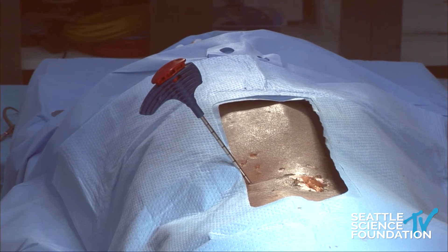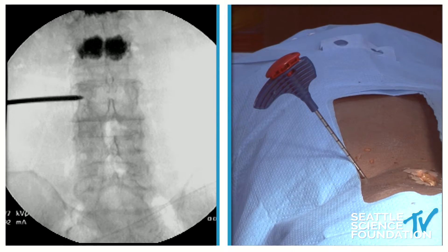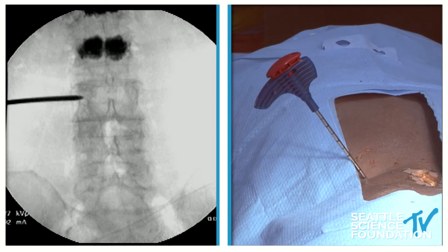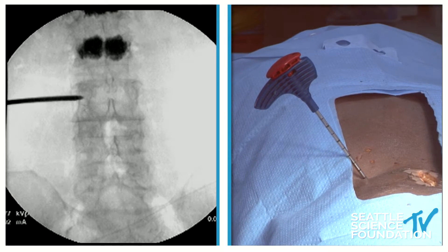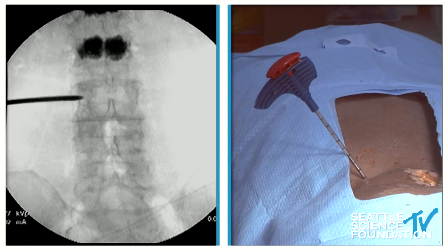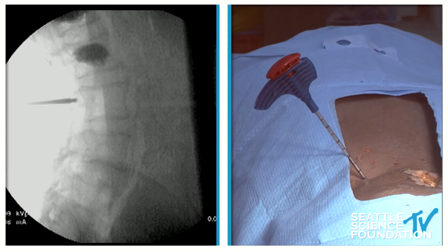Let's take a lateral shot. Once we do this, the nitinol wire or stylet will be surrounded by PEEK — the same PEEK as an interbody fusion case, polyether ether ketone. What we're going to try to do is hit the center of the vertebral body, half the way up from top to bottom.